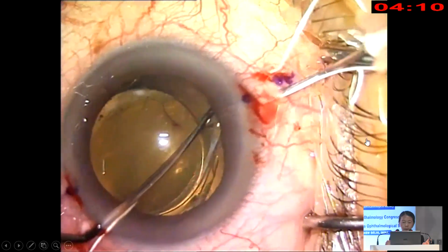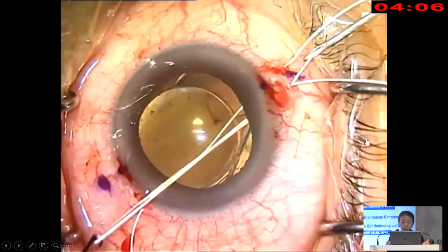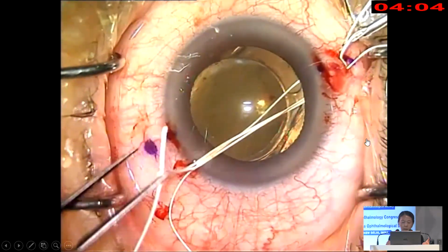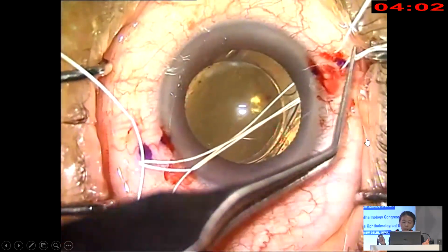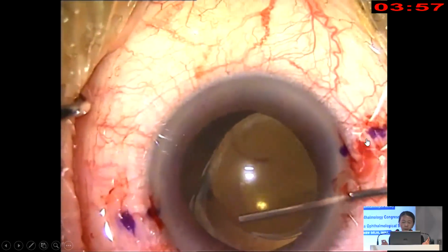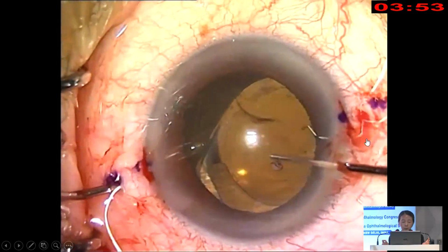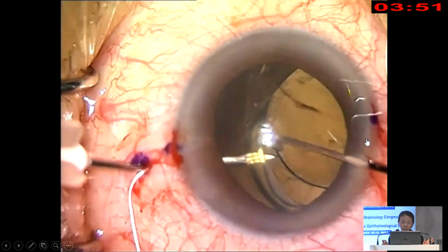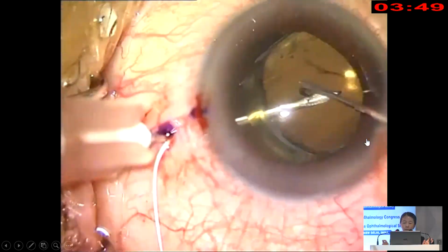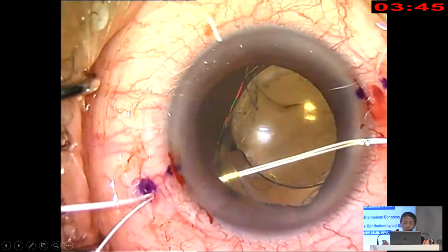You repeat now, going above the complex. Okay, so that's very easy. Thread the end through. You know, these sutures are so easy to handle. They're so easily visible as well. Okay, now when you tug on it, you can see the other side. Some dispersive viscoelastic, there's no vitreous there. There's a patient with retinitis pigmentosa. We're going through the capsular bag complex, extend that lasso.